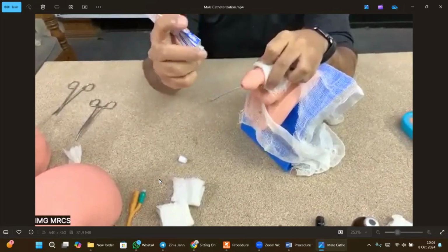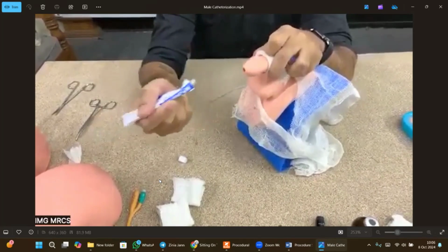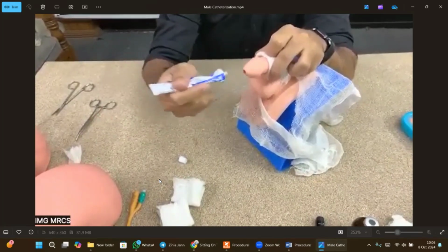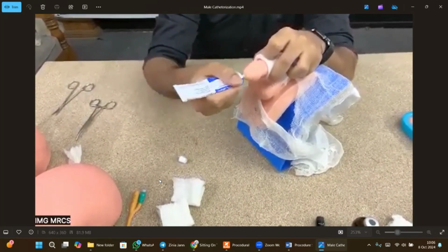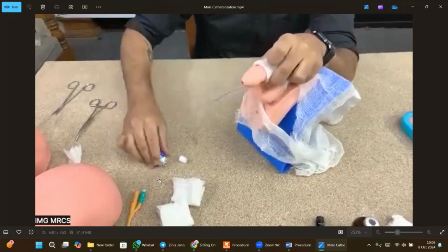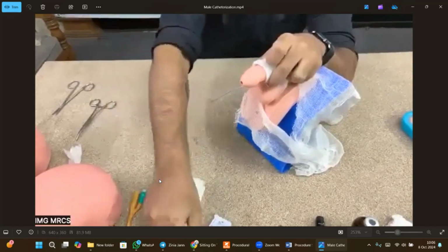And there will be a cap in front of it. I wasn't able to find that cap, sorry about that. So you have to use that cap, and you insert that cap within the glans, and you are going to put a lot of gel inside of the penis. After this, you have to tell, I'm going to wait for 3 to 5 minutes so that the Instillagel can work.